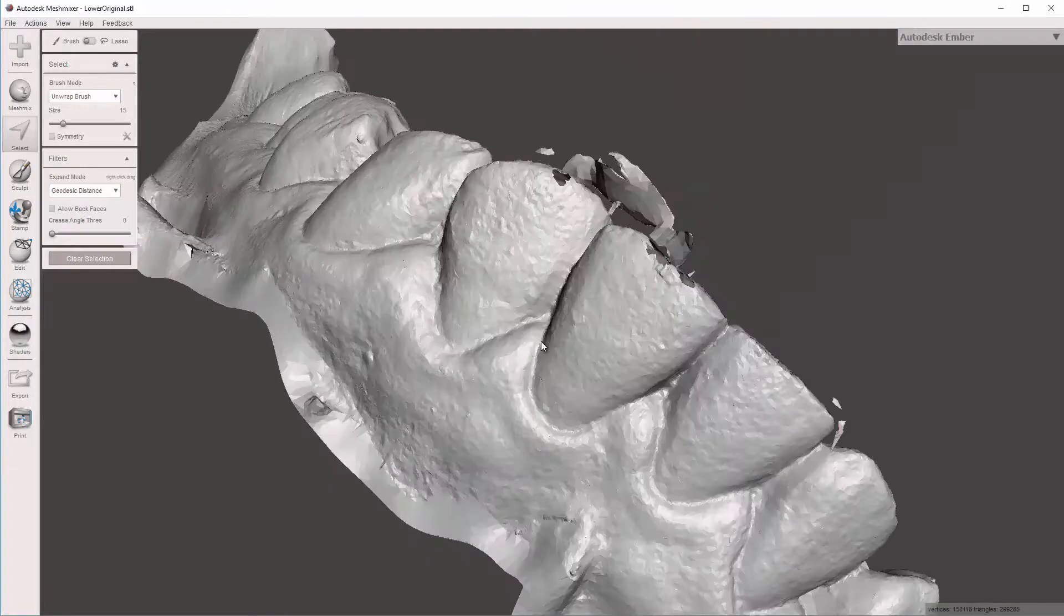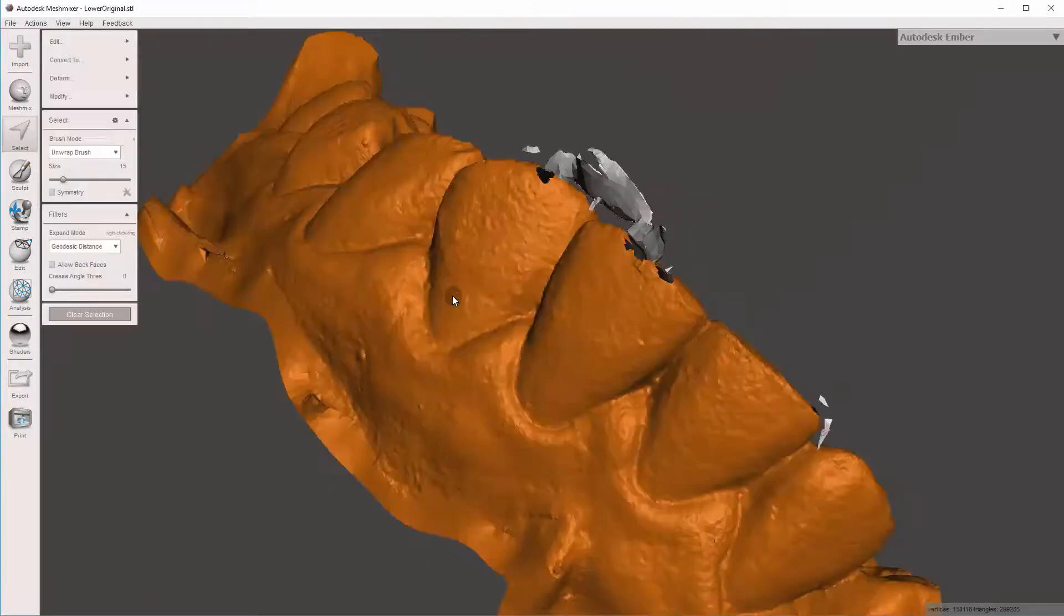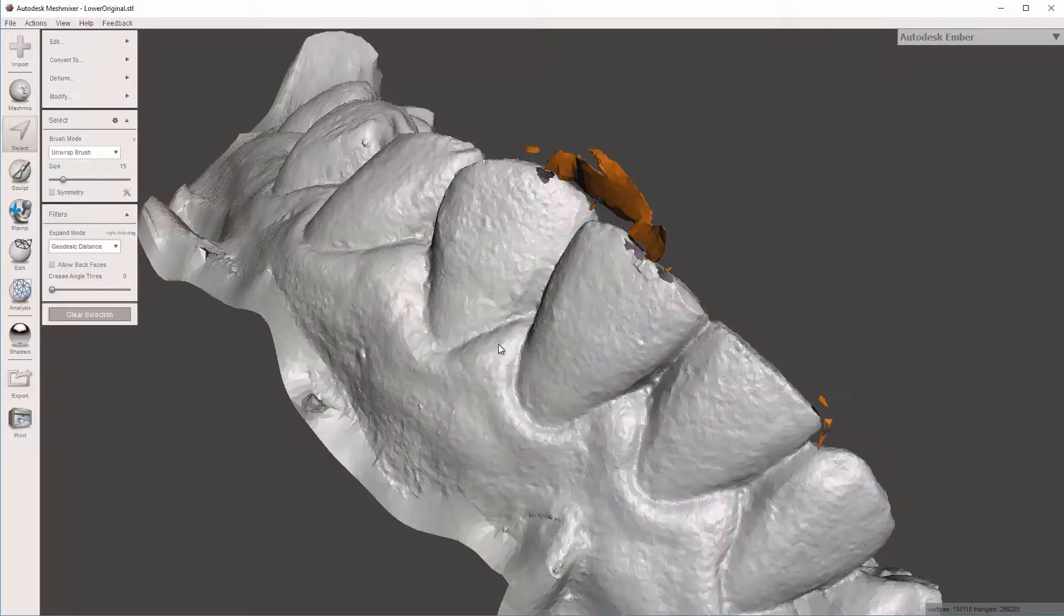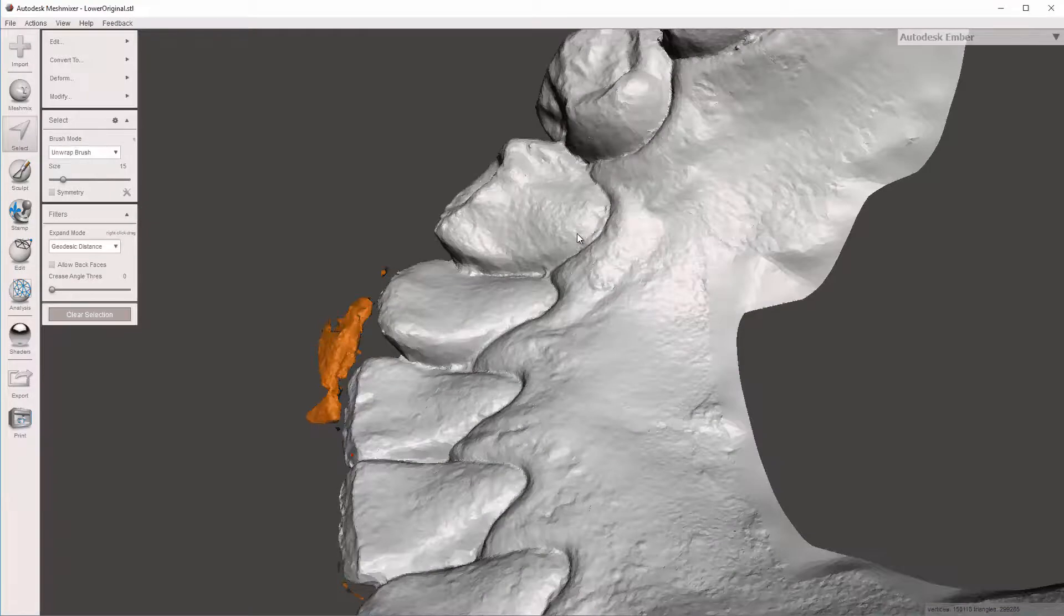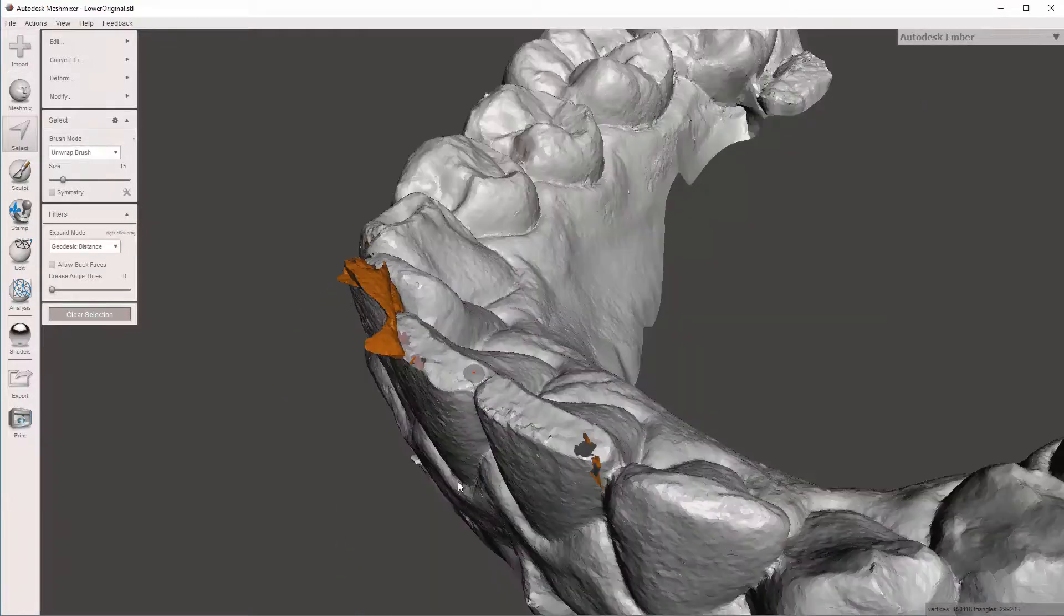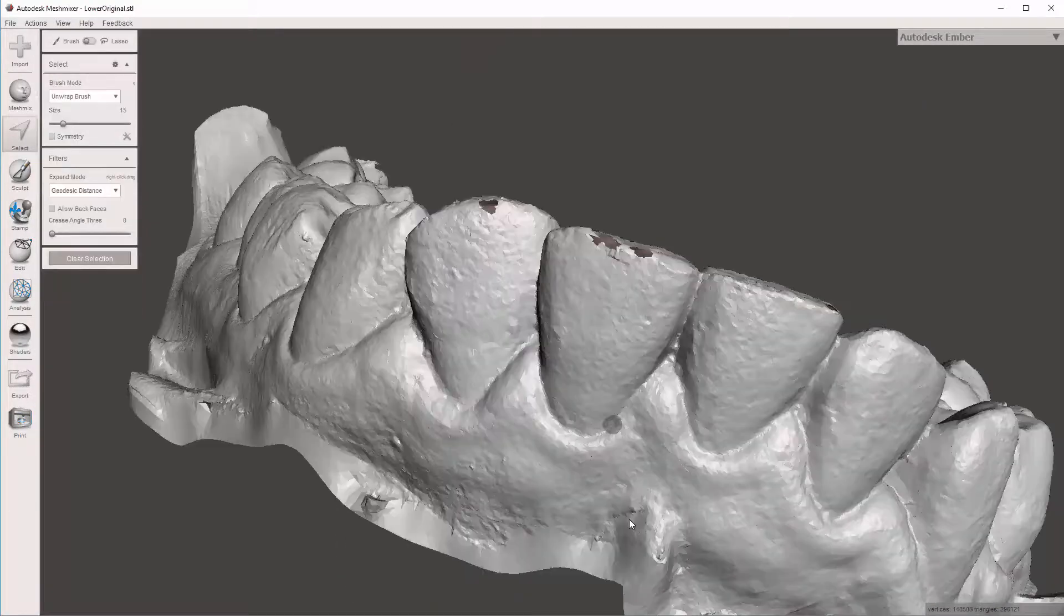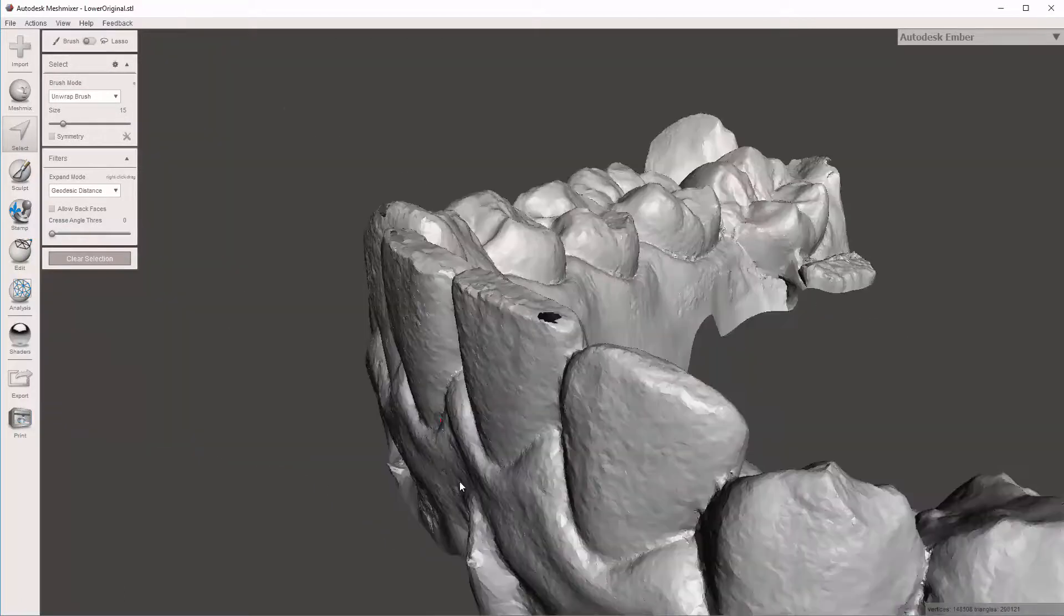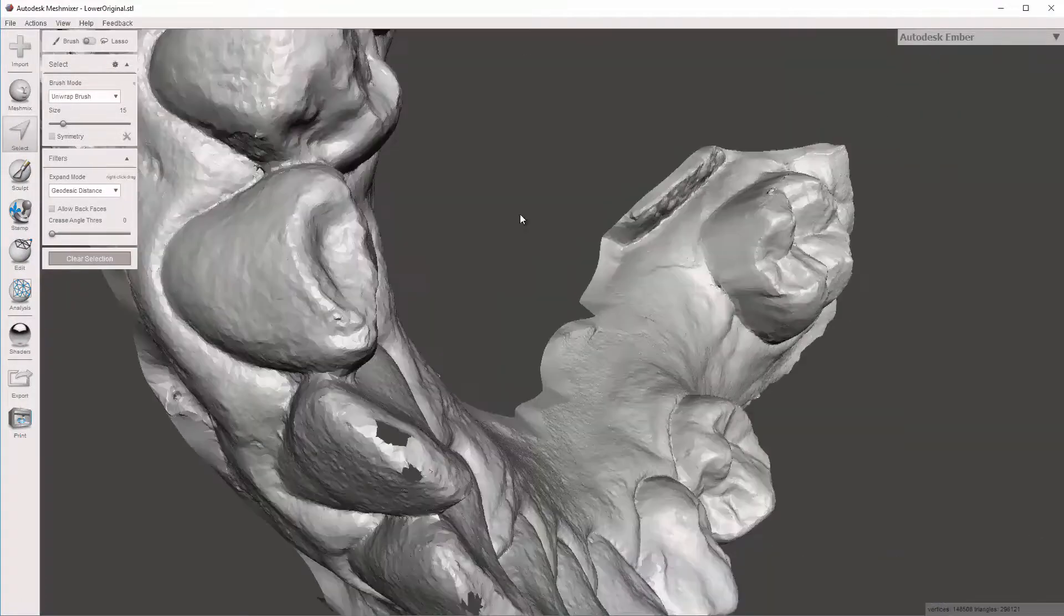So what do we want to do now? We can just go ahead and double-click on the entire main model. And you see everything's highlighted except these pieces, because they're not continuous. If I now press the I button, it inverts the selection. So now only things that aren't continuous are selected. If I hit Delete, they disappear. And now all I have is the model that looks pretty clean, just happens to have a few holes in it.